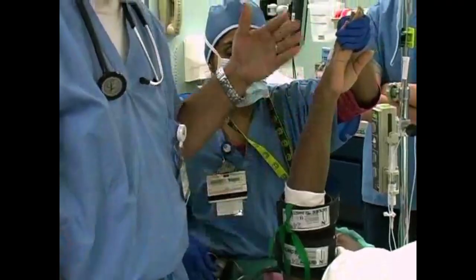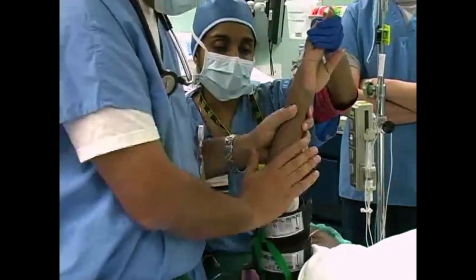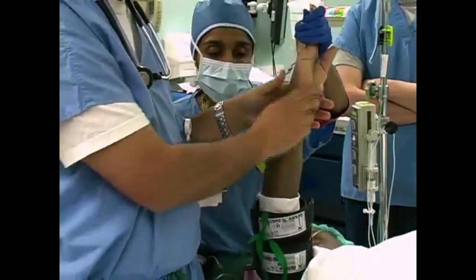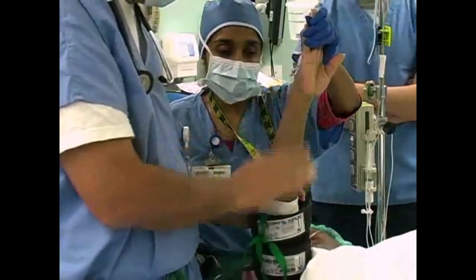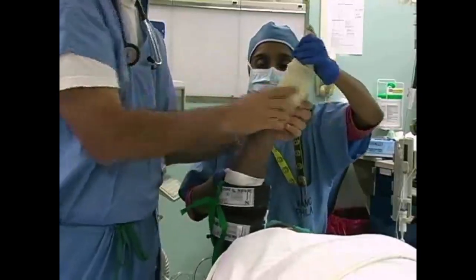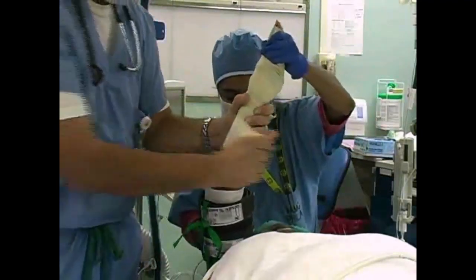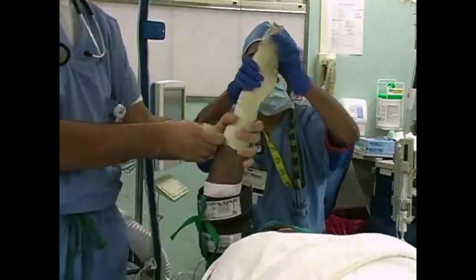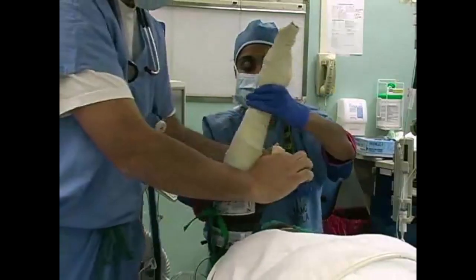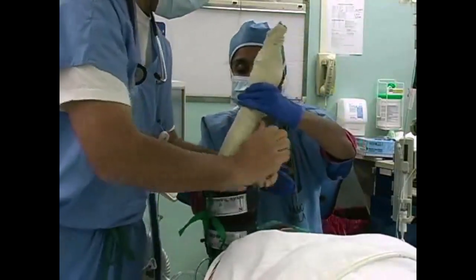Ask an assistant to help you by raising the patient's arm to allow gravity to drain venous blood away from the extremity. Keep the arm in the raised position for at least one minute to allow adequate time for passive exsanguination. After passive drainage, the Esmarch bandage is used to actively exsanguinate the extremity. Starting at the most distal point from the patient's body, wrap the Esmarch bandage tightly around the extremity and proceed proximally until it is flush with the edge of the tourniquet.